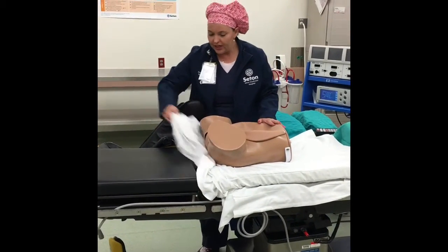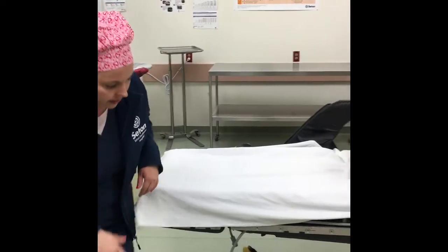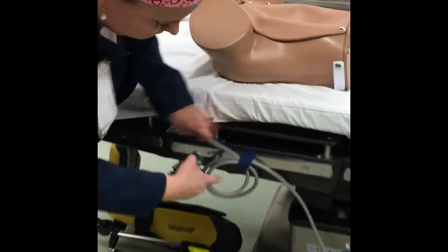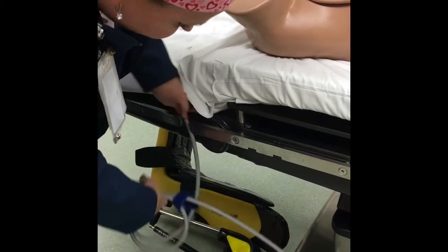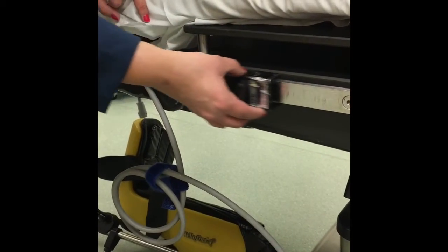So what we're gonna be doing is, and this would still be underneath them, of course, because we're gonna have their feet laying on here. So now we're gonna put the other stirrup on, just as we did the first one. So again, and this is actually in our way, so if something's in your way, you would just move it. So again, you're gonna go from the top until you feel it go down, and it can slide.